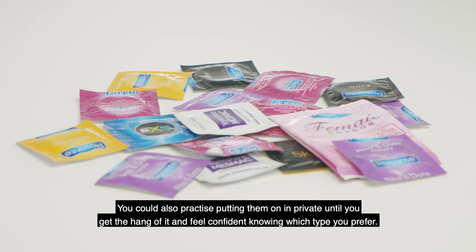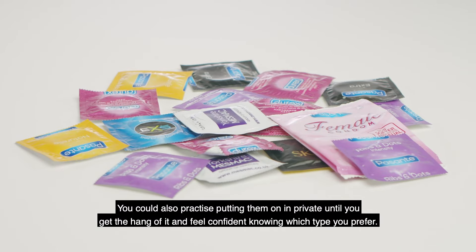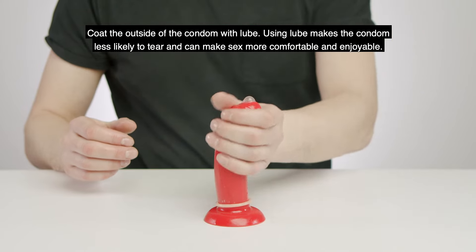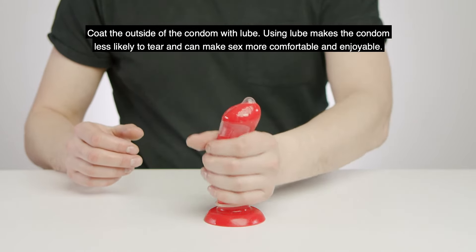You can also practice putting them on in private until you get the hang of it and feel comfortable knowing which type you prefer. Coat the outside of the condom with lube. Using lube makes the condom less likely to tear and can make sex more comfortable and enjoyable.